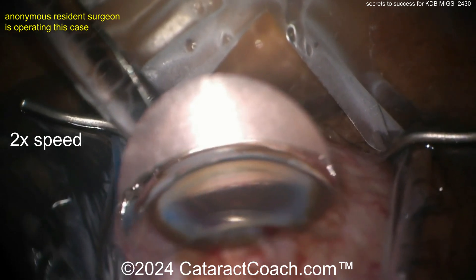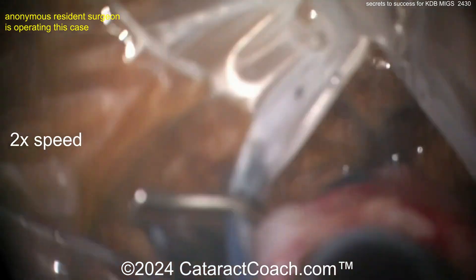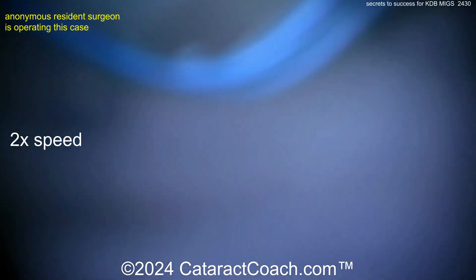This patient is going to have some IOP lowering effect from just doing the cataract surgery, and there's going to be an additional lowering effect from having this MIGS procedure done. Now get the eye back into primary position and get the microscope turned back to where you need it.